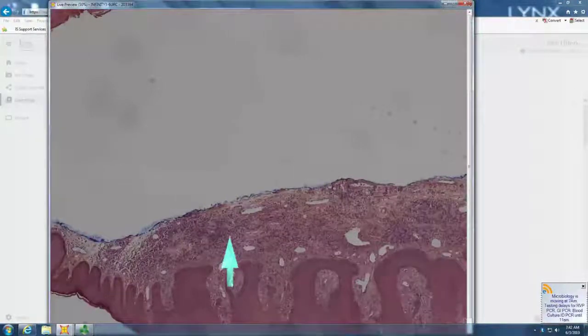Can it be early stage of nevus sebaceous? Interesting thought, except in early nevus sebaceous you wouldn't have the sebaceous gland unless it's immediately after birth, and to have a solitary unit would be unusual. It's usually multiple lined up.